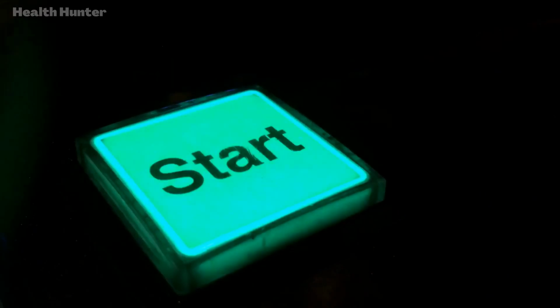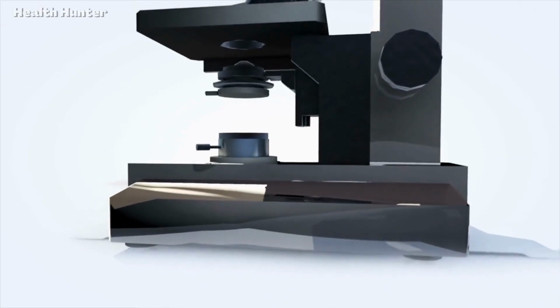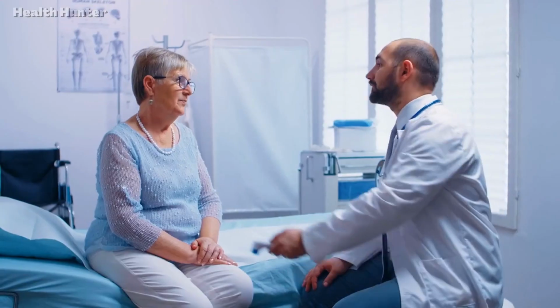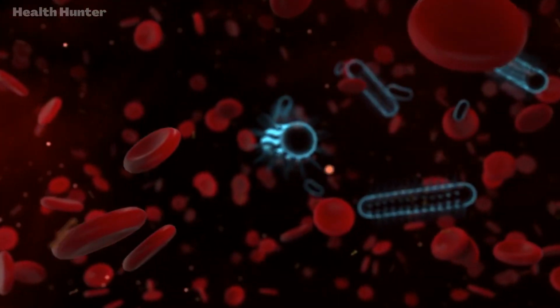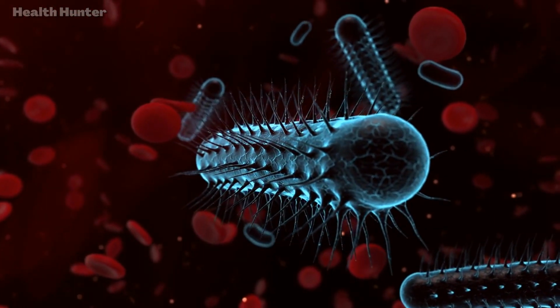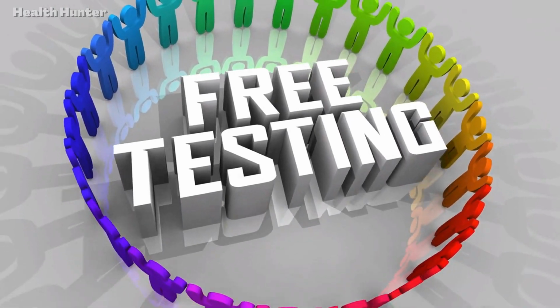Now let's get started. Number 1. Why is stool examination under a microscope important? You may be wondering why. Well, for starters, it can help identify various medical conditions such as infections, inflammation, and even cancer. By examining your stool, doctors can determine if there are any parasites, bacteria, or viruses present in your digestive tract that could be causing your symptoms. It's a simple and non-invasive test that could potentially save your life.